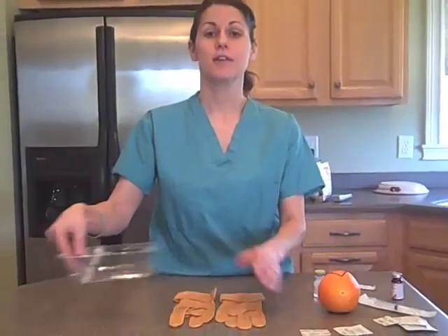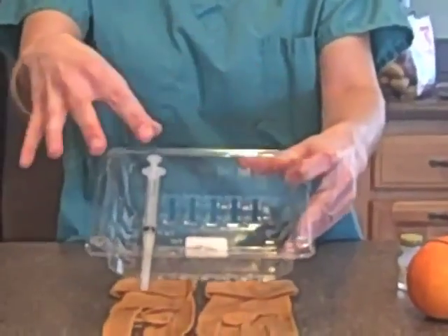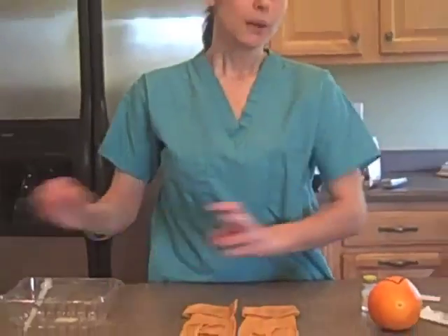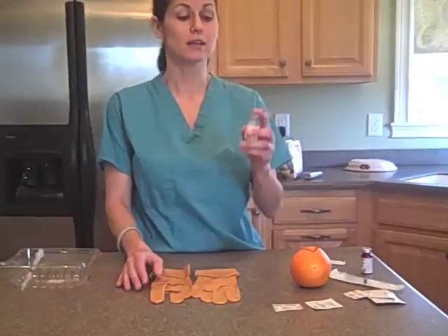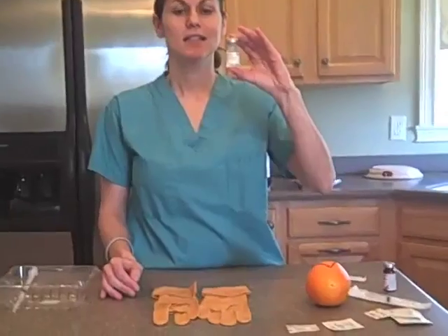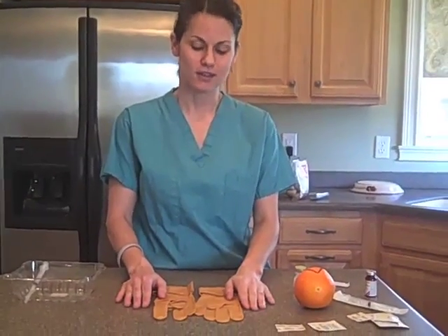Most vaccines today are given with pre-filled syringes, such as this. They usually come in about a pack of 10. But some vaccines come in multi-dose vials, like this. Today, we're going to show you how to give an intramuscular shot, which is the technique used to give vaccines.